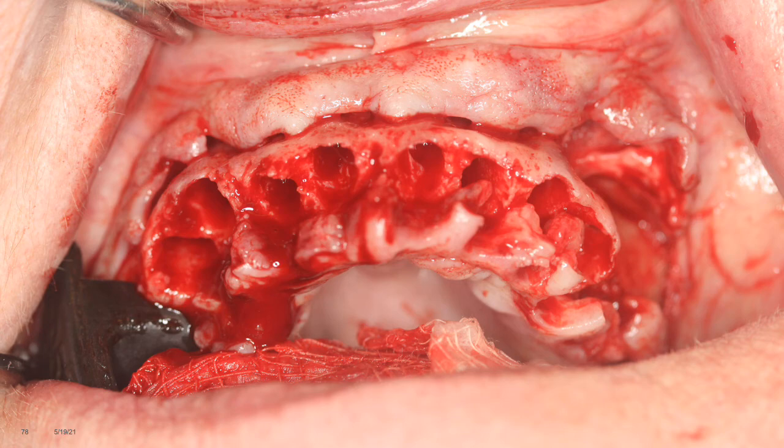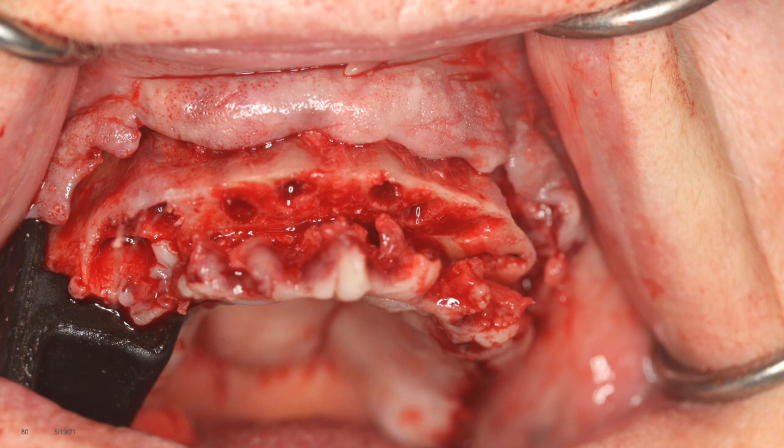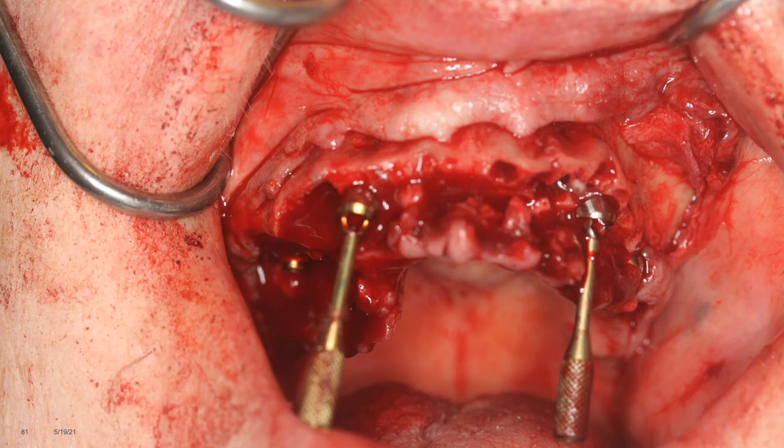The first step is we actually edentulate the patient. Using a guide, we mark the area of how much has to be reduced. Again, a lot of patients have periodontal disease, a lot of bone loss, so in this case, not that much bone had to be removed. Then we section the bone to be about 15 millimeters measured from the incisal edge of the opposing arch, so we can get all of that room in there. We'll take a big sagittal saw and just zip it right off, and we'll create that space. We'll place the implants themselves.